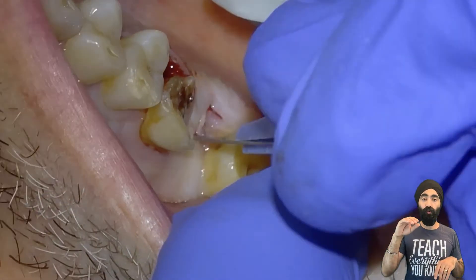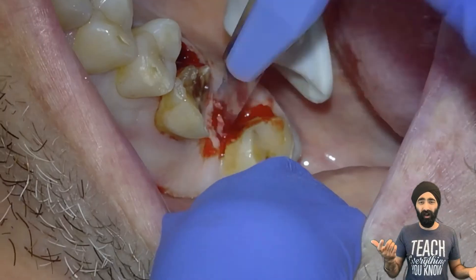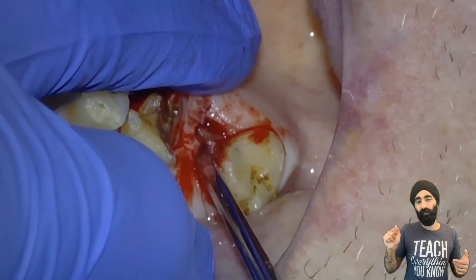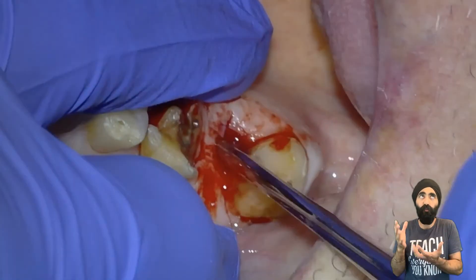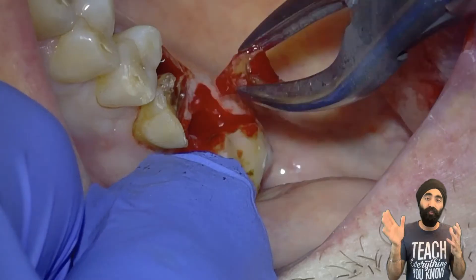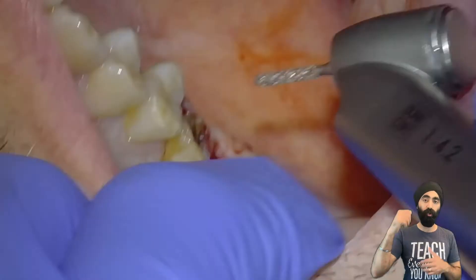I first get a scalpel and remove a bit of soft tissue overlying that retained root of the upper right seven. In the past, I tried to just go through the soft tissue and luxate the root out, but there's a soft tissue impaction there. If you just quickly get rid of the soft tissue — obviously this video is at two times speed — it makes it so much easier to remove.